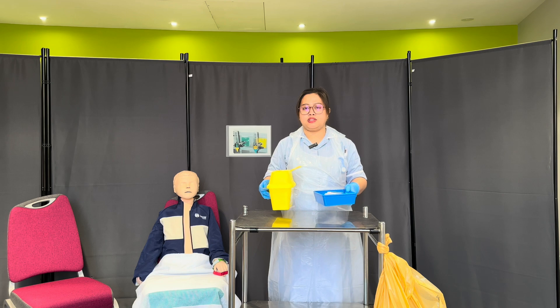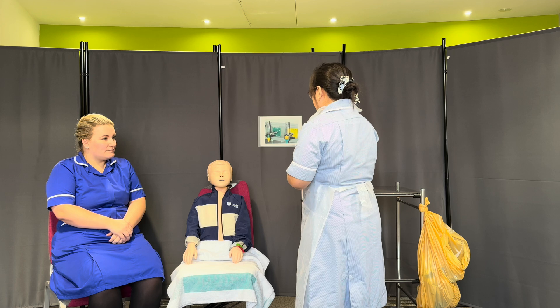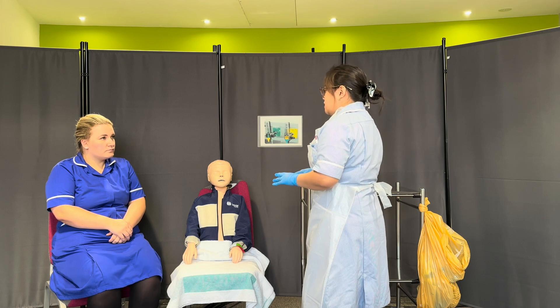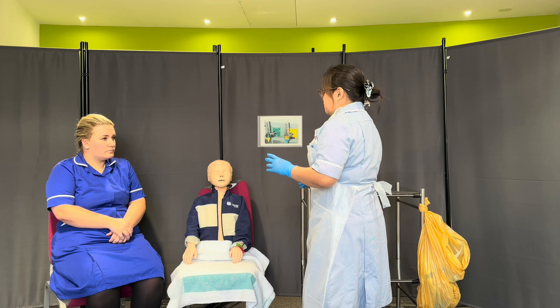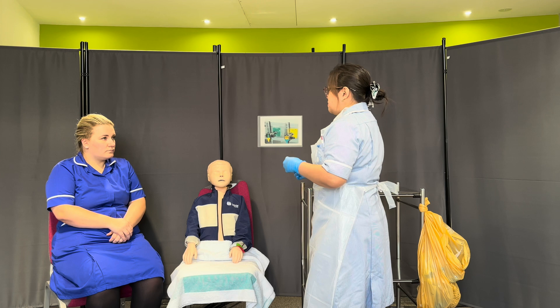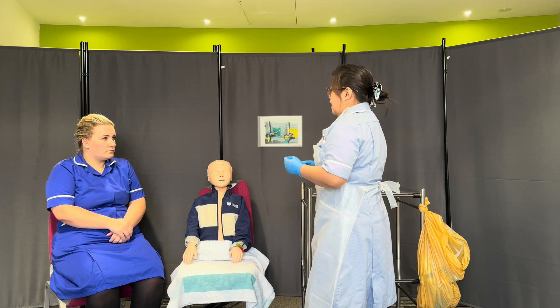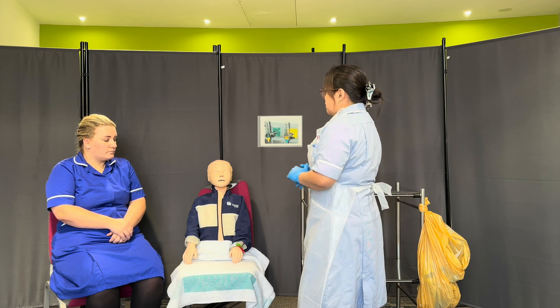So I'm now ready to approach my patient. Hello, good morning. How are you? Good morning. So Mary, I already have my equipment here with me. I'm here today to take your blood glucose. Earlier in the morning, before your breakfast, they took your blood samples for a blood glucose test. The doctor has asked me to take another blood glucose sample after a meal. Can I ask if you've already had a meal? Yes, she's had a meal. Okay, that's good to hear.